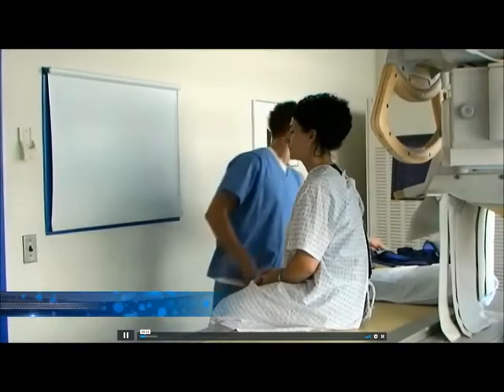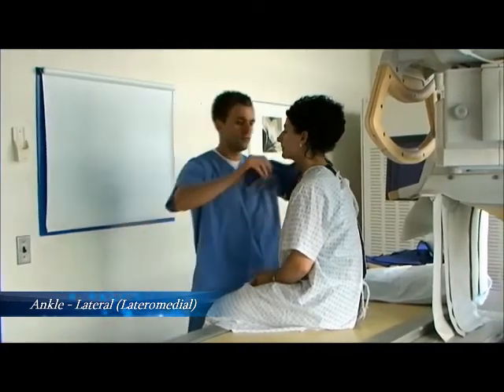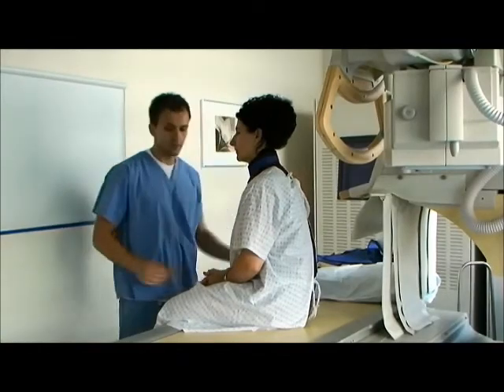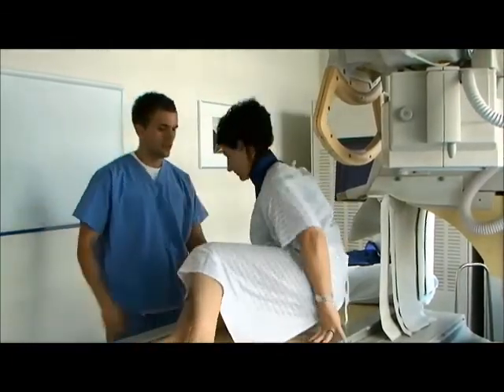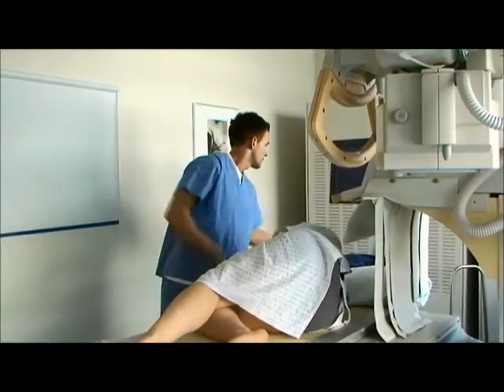Begin with the patient seated on the table. Be sure to apply proper shielding, paying special attention to the thyroid gland, mammary glands, and the gonads. Note that the gonads and mammary glands will be shielded after the patient is instructed to lie on their non-affected side. A half apron is sufficient for both areas being covered.